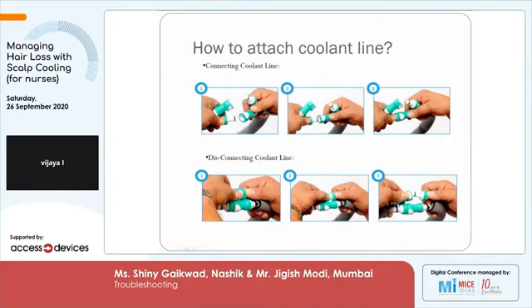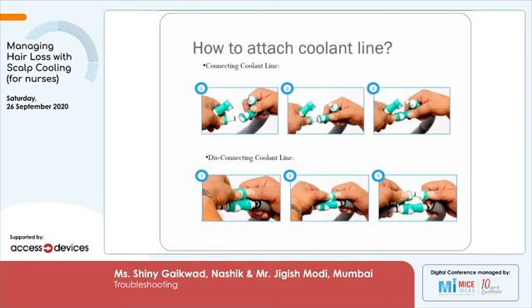This is how we attach and disconnect the coolant lines. On the side of the cap and on the side of the patient tubings there is one male and one female connector. They have to be inserted only in one way and you have to hear a distinct click sound to ensure proper connection of the cap. For disconnection, you have to press the white button very gently and effortlessly the connectors will come out.